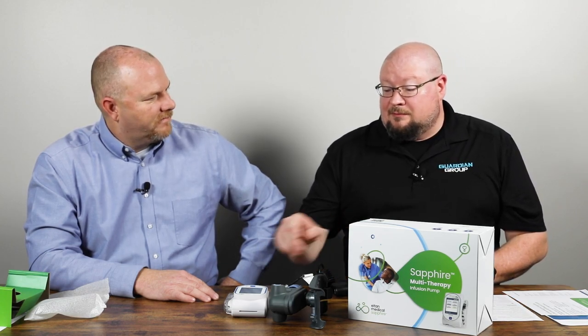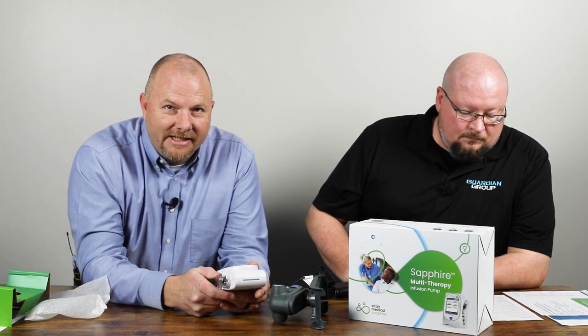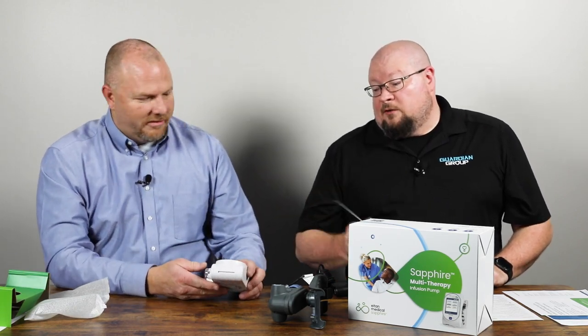Plus the portability — you can carry it in your cargo pants pocket, which is awesome. One thing I didn't mention earlier on the specs that is huge, especially in the EMS field, is battery life. This has a very robust battery life: 24 hours infusing at 125 cc's an hour. I can't think of any other device on the ambulance that has that type of battery life — even the cardiac monitor won't last that long. What's really cool is it's going to hold that charge too. You take it off the charger and it's going to be good for a week, two weeks. Even if you forget to put it back on the charger, you don't have to worry about it losing that extended battery life.